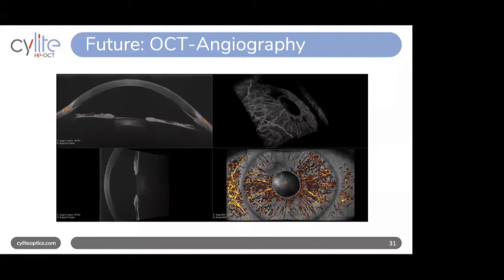It's the only place where you can really see what's going on in blood vessels that feed the retina. You can also see those blood vessels in the front of the eye, with a thing called angiography. And it was interesting, and I didn't realize this, but a friend of mine I found recently had a leukemia diagnosis about 25, 30 years ago. And the diagnosis was made from the image, a photograph of the retina of his eye and the blood vessels, what's happening in the blood vessels.